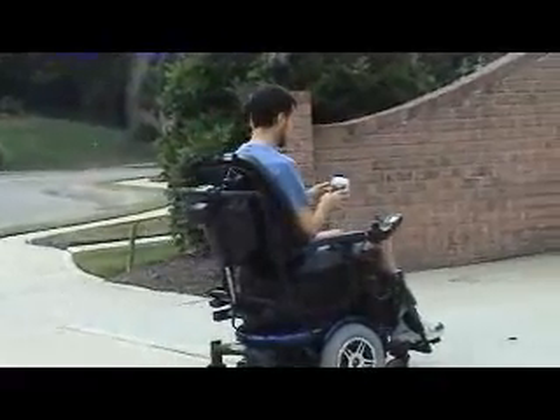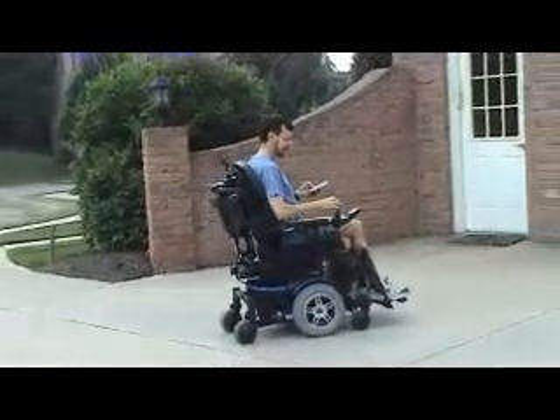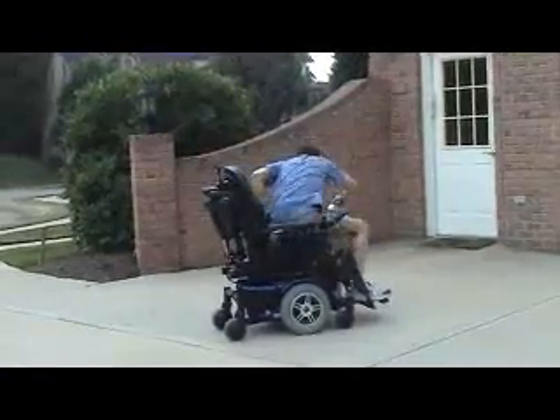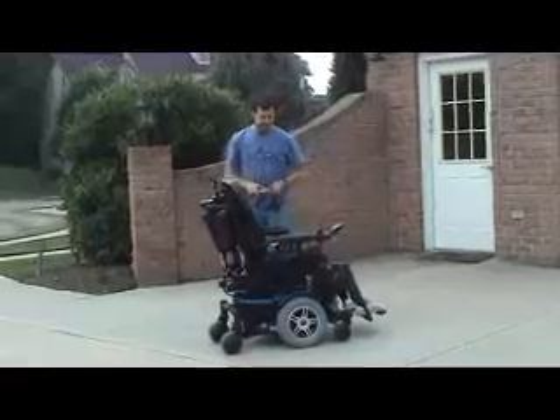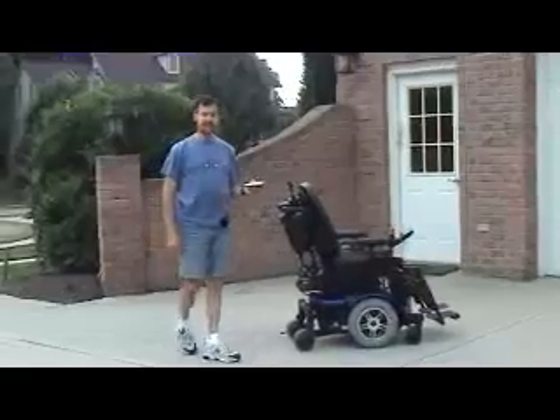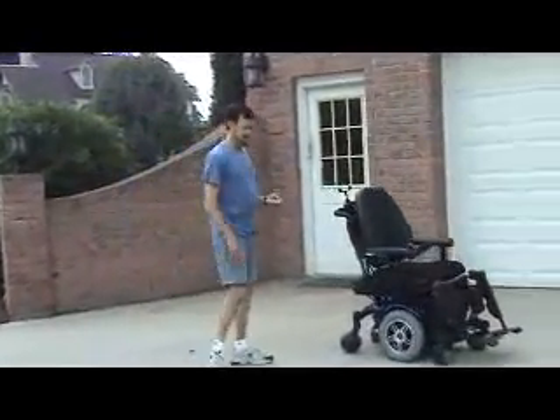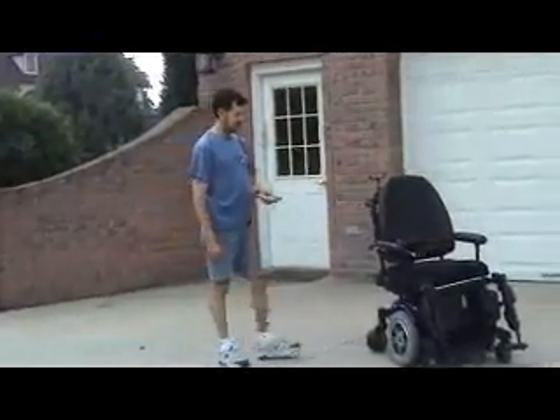The cool thing is it's totally wireless, so I'll stop for a second. I'll get off and start her up again. Now I can control it from alongside. It's in a right turn — I'll hit straight now.